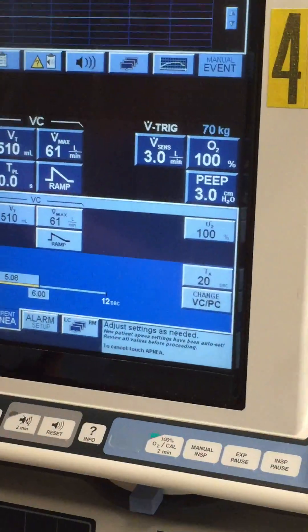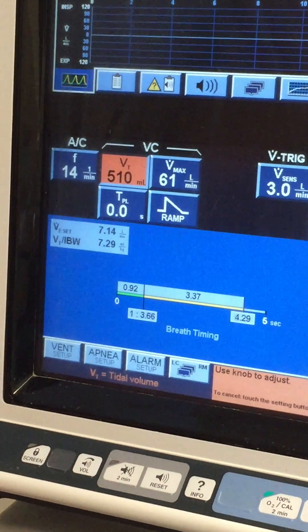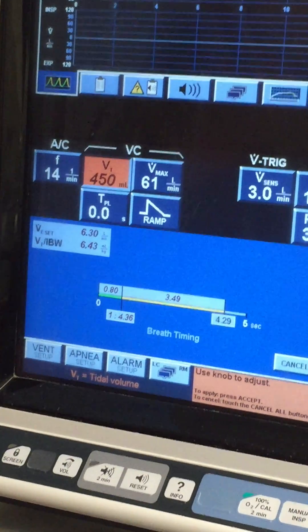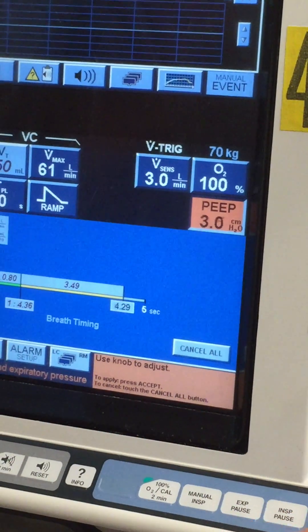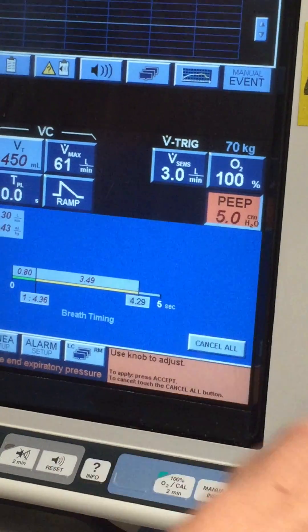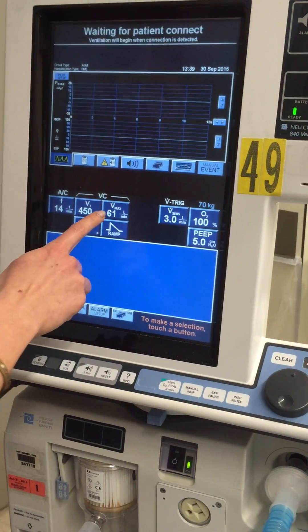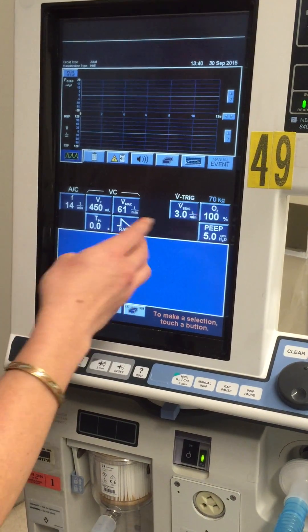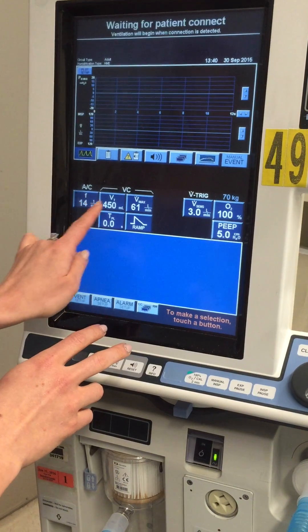From here we can control the other settings. We're going to change the tidal volume to about 450, depending on how large your patient is. We'll change the PEEP to about 5, which is kind of our basic, and we're keeping the FiO2 at 100%. Other settings here — you can see the flow rate as well as the pressure — those aren't really necessary. The ones we're concentrating on are these four.